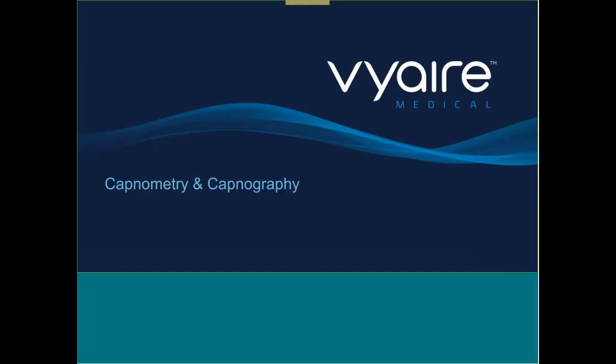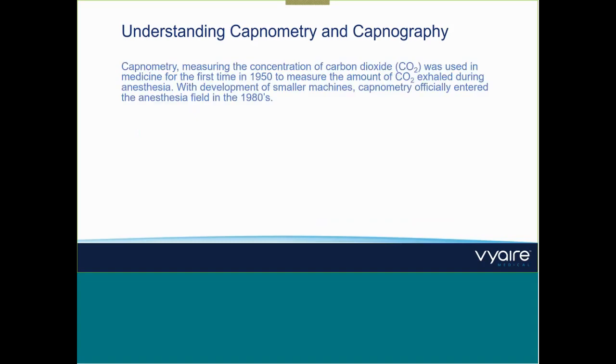Okay, so now talking about capnometry and capnography. The whole process, but these were quite bulky machines, started in the 50s, and on a regular basis mainly in anesthesia when the devices were getting smaller and smaller. Capnometry and later capnography was used from the 80s on. Nowadays, it's a must-have in anesthesia for certain reasons. It's also a standard. And unfortunately, it's not used on a daily basis in ICU and in ICU ventilation. I always wonder about that, many people seem to think this is not necessary because they have blood gas. But as I already said, it could spare a lot of money because blood gas analyzers are still quite expensive. And I still don't understand why capnometry and capnography is so rarely used in ventilation.